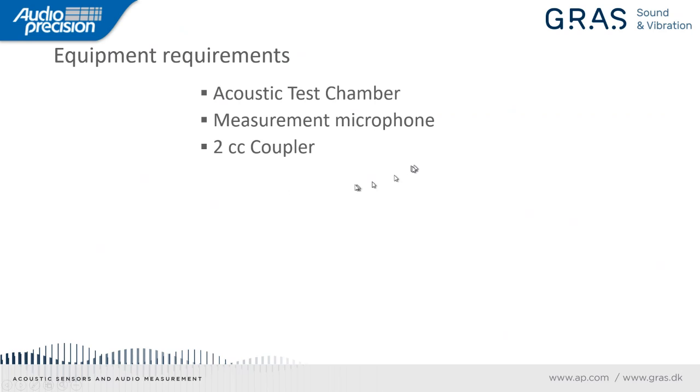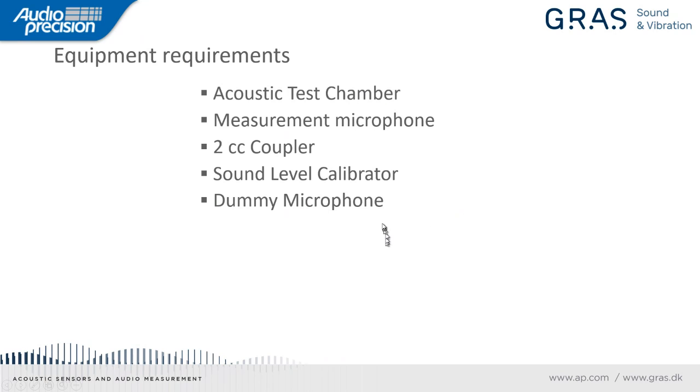I have some pictures in subsequent slides. It's very good to have a sound level calibrator, and what this does is it generates a known sound level, and you can use it to set the sensitivity of the microphone within the software of the audio analyzer. We also need a dummy microphone, and I'll explain what that is in an upcoming slide.